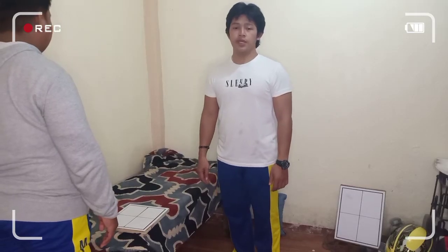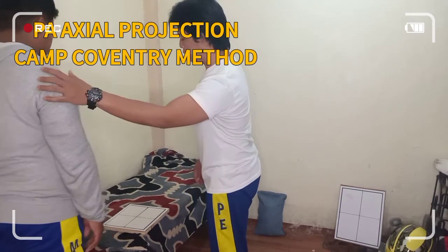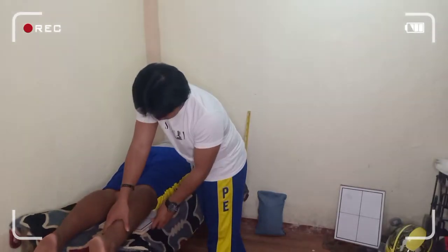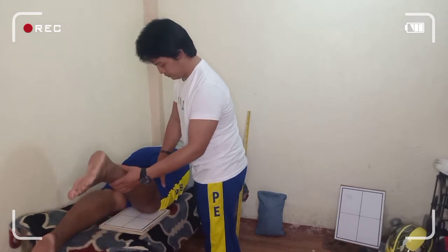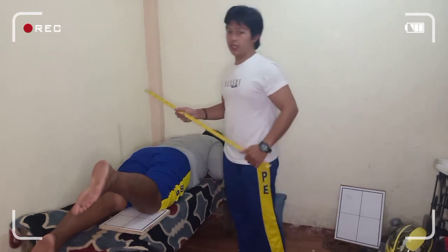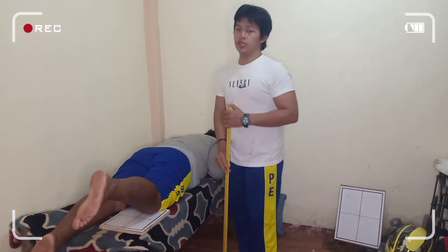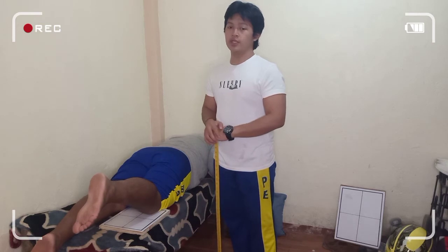The next projection is a PA axial Camp-Coventry method. Place the patient prone on the radiographic table. And place the knee on the image receptor. Instruct the patient to flex the knee by 40 to 50 degrees. The central ray must be perpendicular to the leg at 40 to 50 degrees caudally. The structure shown in this projection is the intercondylar fossa, medial and lateral intercondylar tubercles.